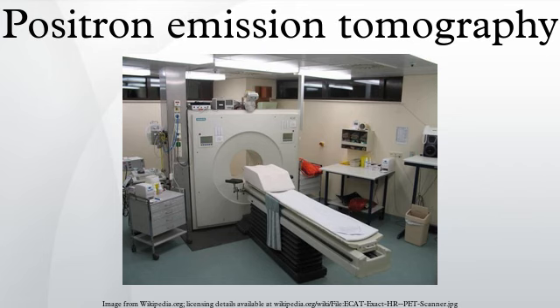However, it is possible to acquire PET images using a conventional dual-head gamma camera fitted with a coincidence detector. The quality of gamma camera PET is considerably lower, and acquisition is slower. However, for institutions with low demand for PET, this may allow on-site imaging, instead of referring patients to another center, or relying on a visit by a mobile scanner.